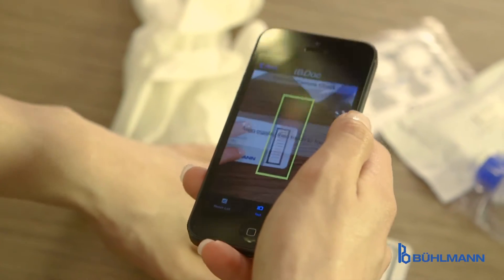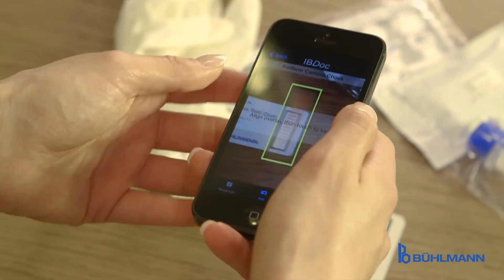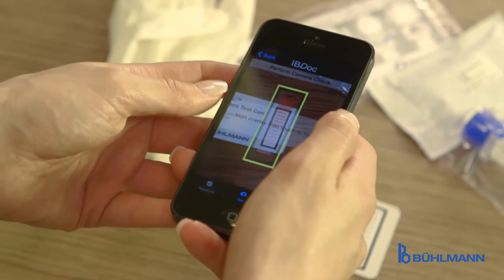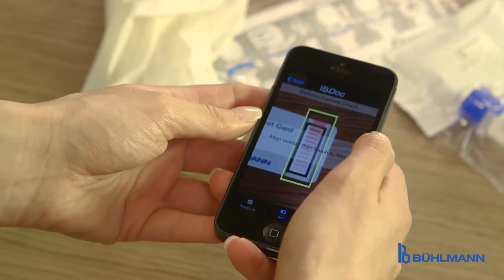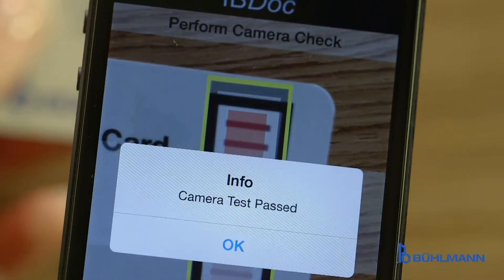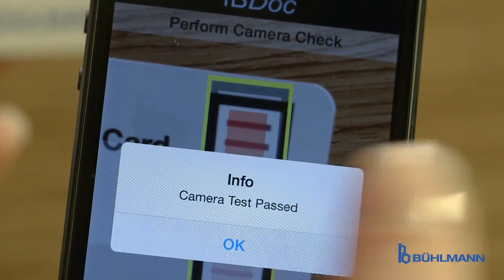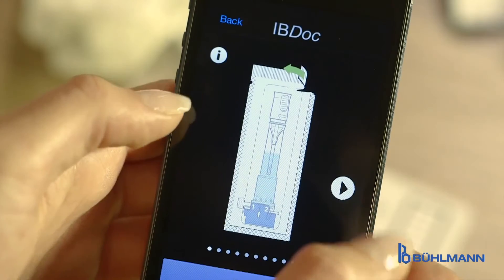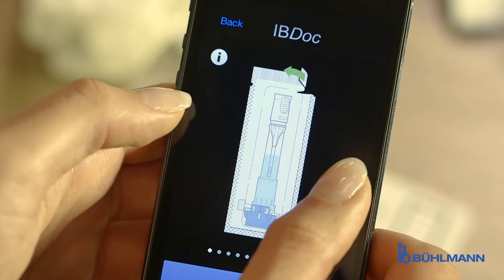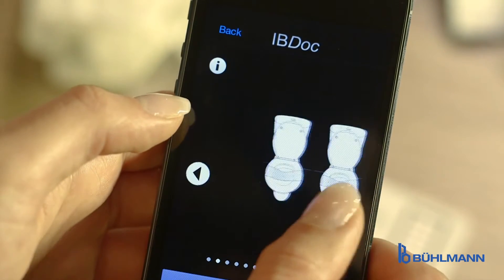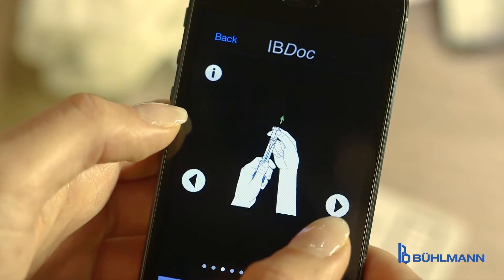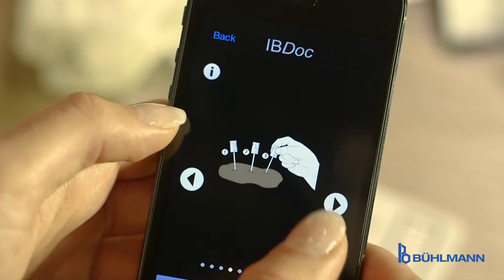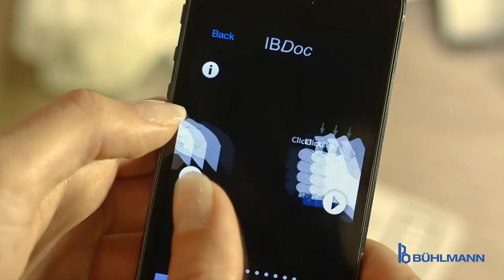A simple camera check confirms the smartphone camera is ready to perform the task. The following is a simple procedure performed in three main steps, all described in the app tutorial menu whenever needed.